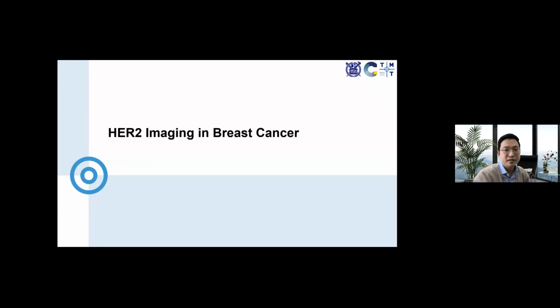All right, let's move on to the second part of today's talk. The talk is moving forward to the future, from the NCCN guideline and the potential value of FDG PET scan, to a new tracer for HER2 imaging.